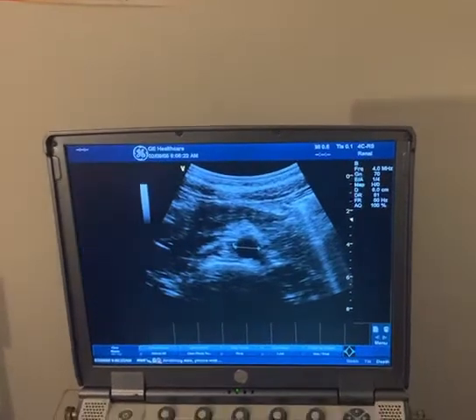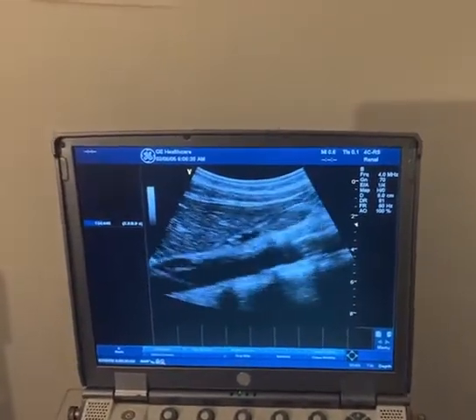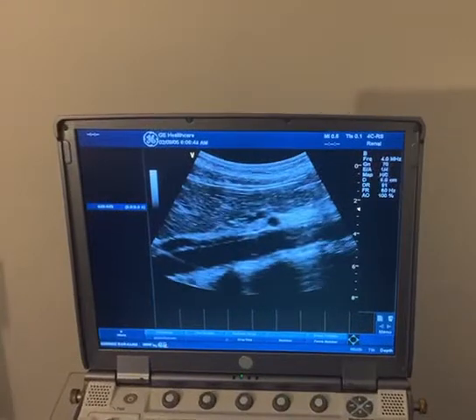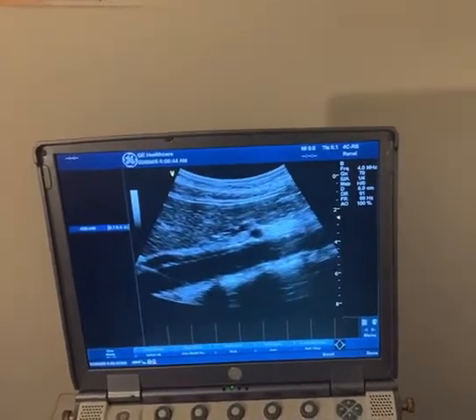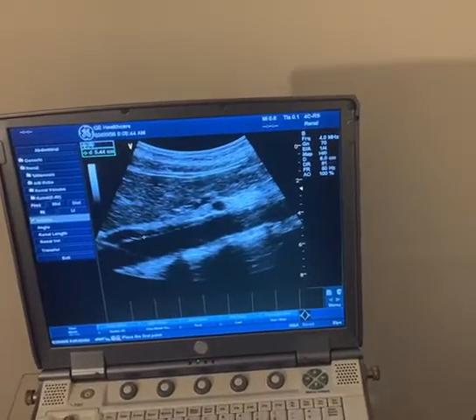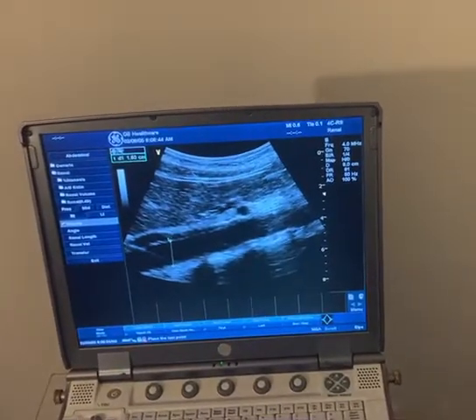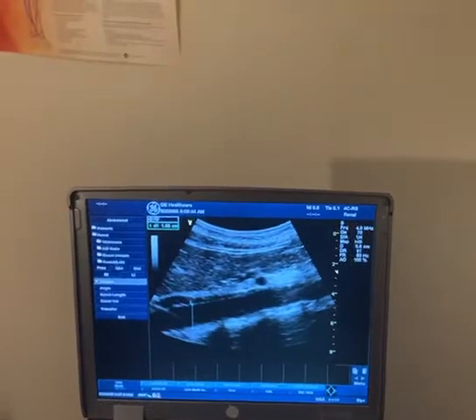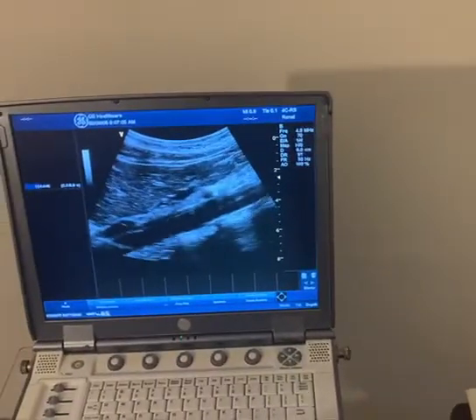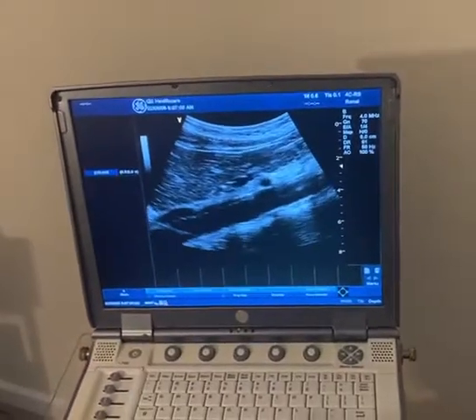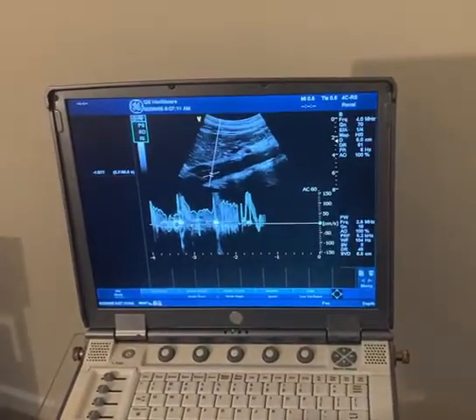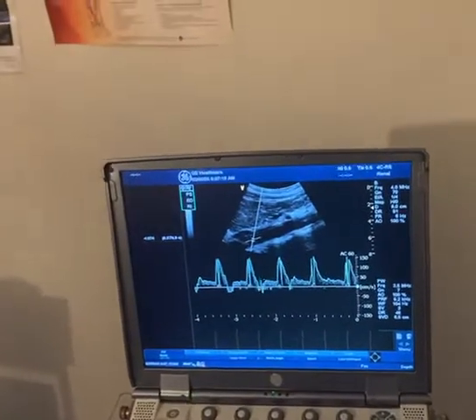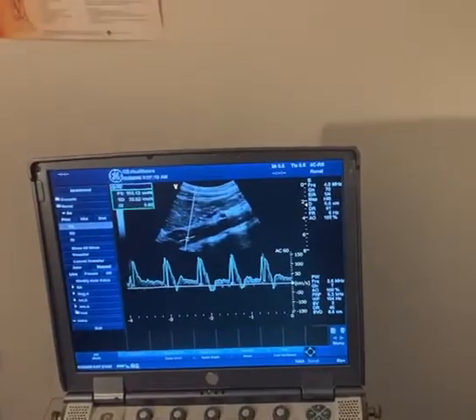I'm going to unfreeze and take it in a sagittal image now — turning right away from my proximal transverse image to my sagittal image. I'm going to freeze that again right at the proximal and measure my aorta outer to outer. You want to get all the walls in that image. I just did a proximal aorta measurement in sagittal and transverse views. Right at this level, I also go ahead and get my waveforms of the proximal aorta. That's the proximal aortic velocity.